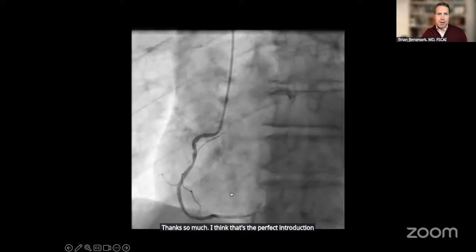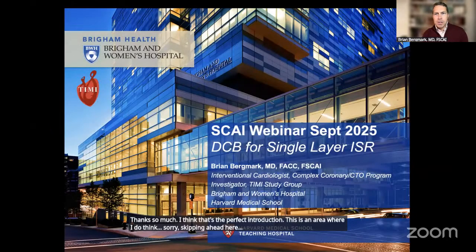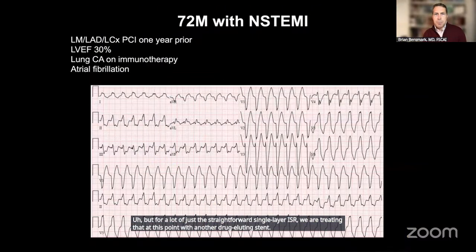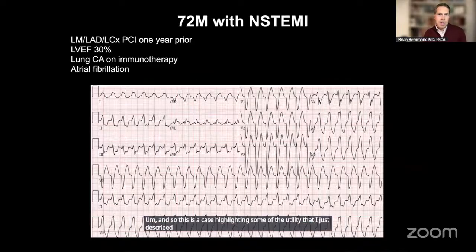Thanks so much. I think that's the perfect introduction. This is an area where I do think there's a lot of variation in practice, and our own practice is evolving. And we'll get into this case, but particularly scenarios where there's a long segment of ISR and you don't want to restent a lot or a bifurcation. But for a lot of just the straightforward single layer ISR, we are treating that at this point with another drug-eluting stent. And so this is a case highlighting some of the utility that I just described for single layer ISR.